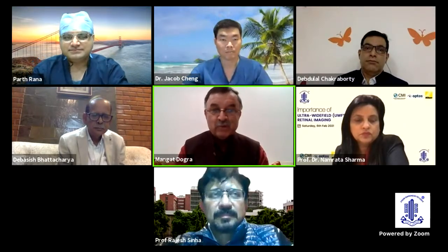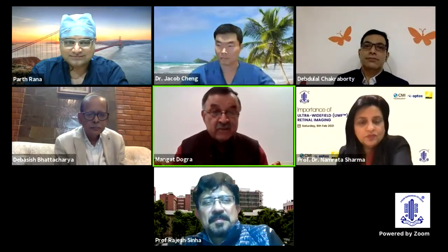There's no doubt. I absolutely echo what Dr. Devashish has said. Do you think it is going to be a retinal assistant to us, without having a human face to it, for the anterior segment surgeons? Exactly, very true. I can tell you, Dr. Amrita, once you can get an image through a small pupil and see that there's nothing grossly wrong, that is the way it is going to be. And it is becoming more important because, along with this, they have already incorporated OCT also, I think, in one of the models now, the recent one.